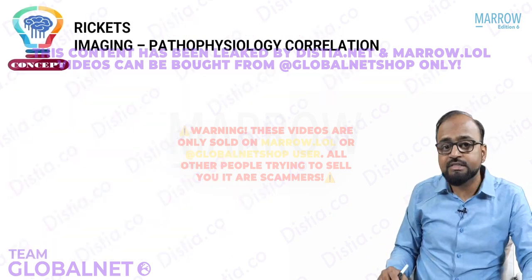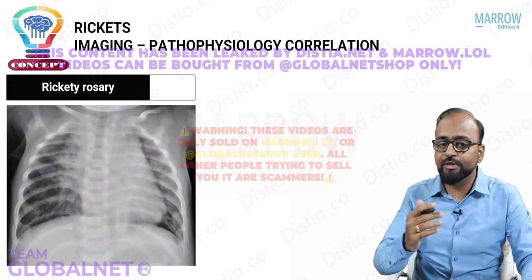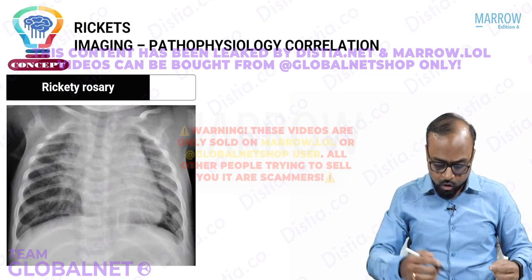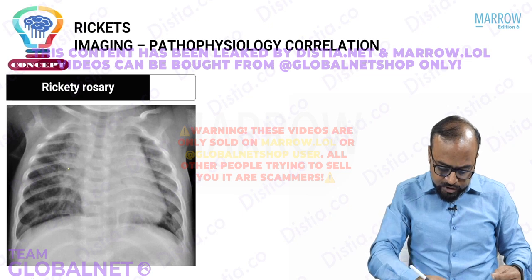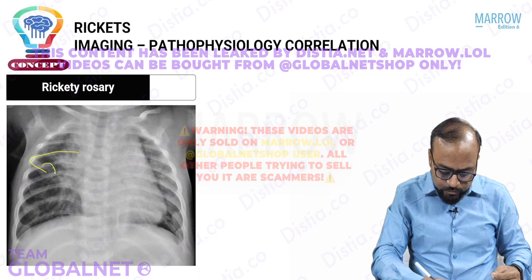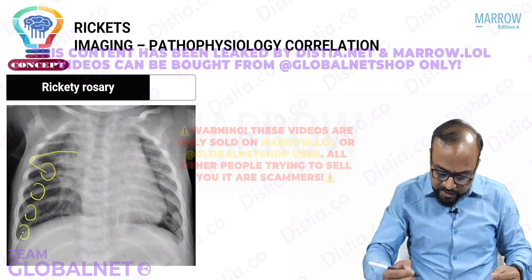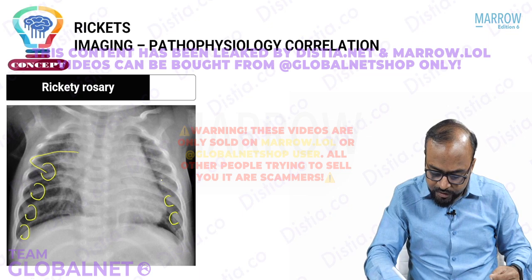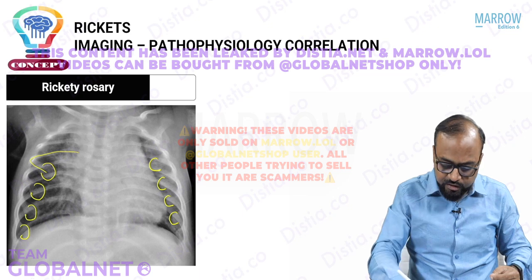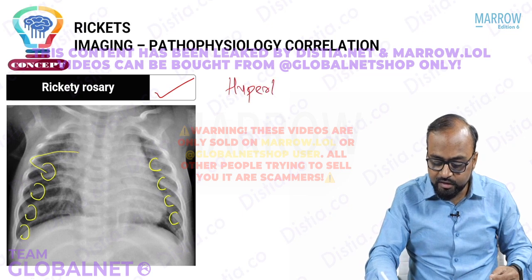Now there's another finding which is seen in rickets, and that is called rickety rosary. What is rickety rosary? In pediatrics, you must have seen a clinical photograph where we see these round beads at the costochondral junctions. On a radiograph, if you watch very carefully, see if this is a rib, this is the anterior end of a rib, you can see that there is expansion of the anterior ends of ribs. Right? In a child, expanded anterior ends of ribs, like this, most common cause is rickets. This is what is called rickety rosary. This happens because of the hypertrophied cartilage.